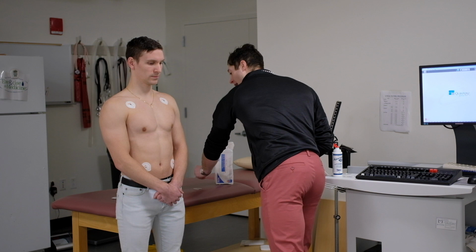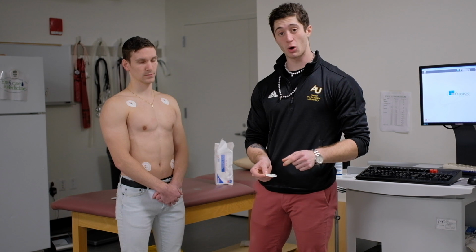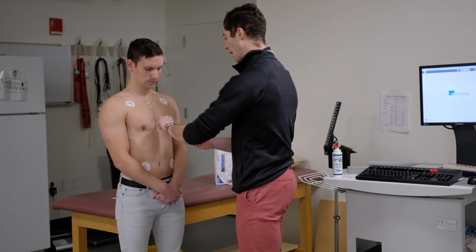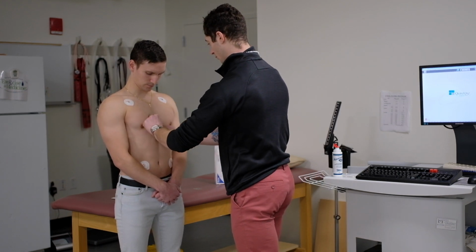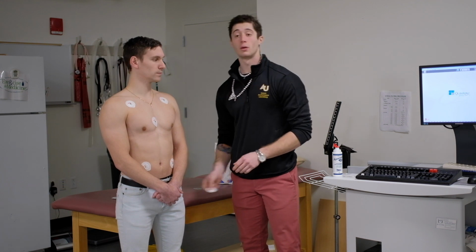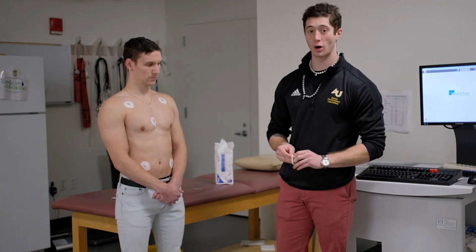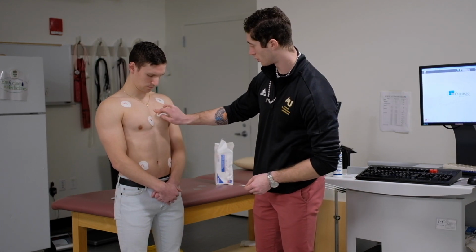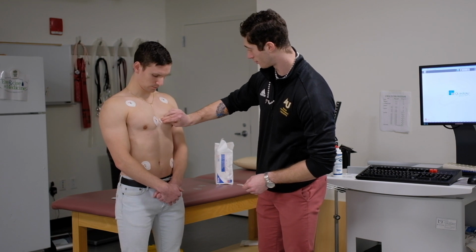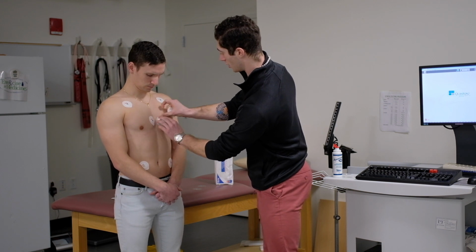Once again, you would have wiped down using your gauze, ensuring that there is nothing left on the skin. Place the ultrasound gel on the back of the electrode, and go ahead and find that spot. V2 is going to go directly across from it. You can palpate if you'd like, however, that's not entirely necessary, as most of the time the ribs are a mirror image of each other. Once again, wipe down, place the ultrasound gel on, and place the lead.